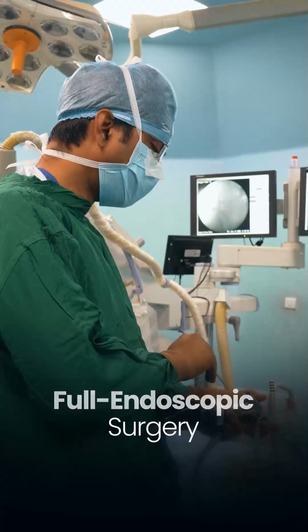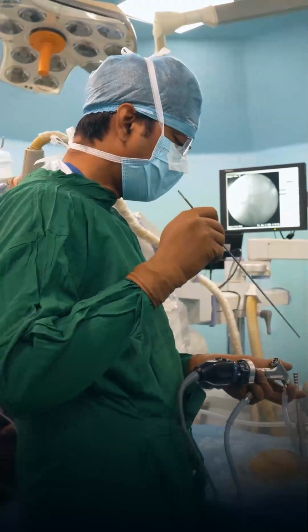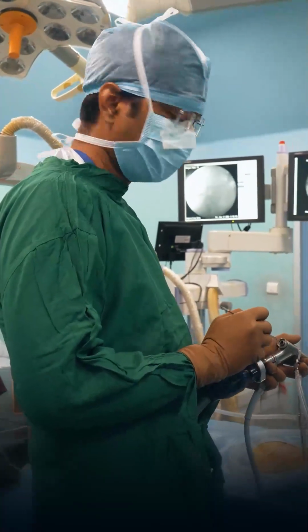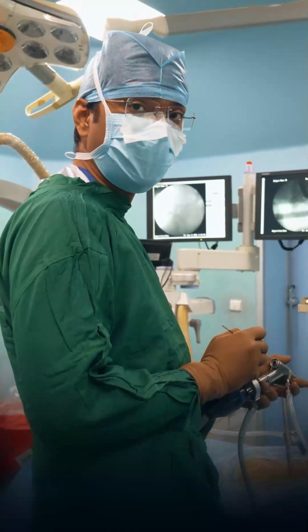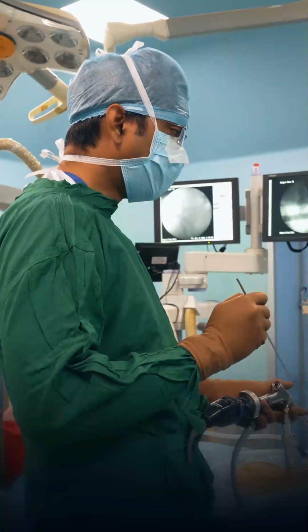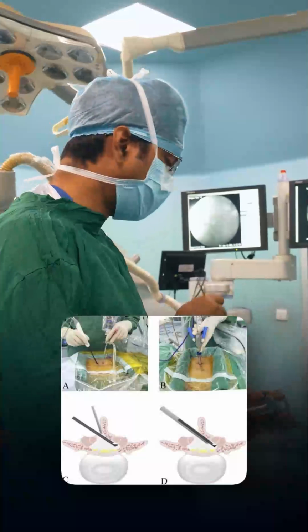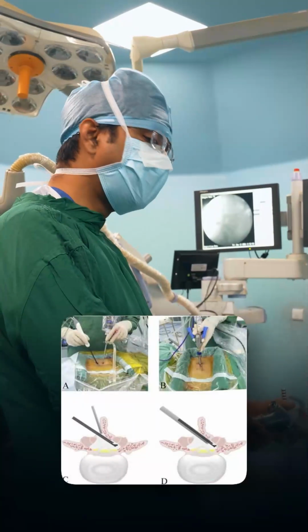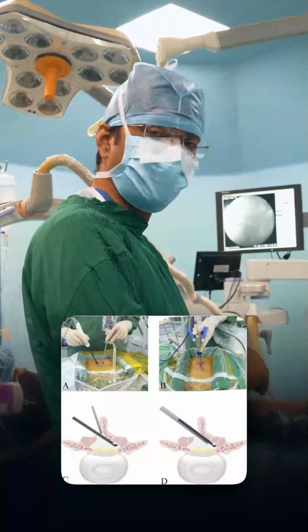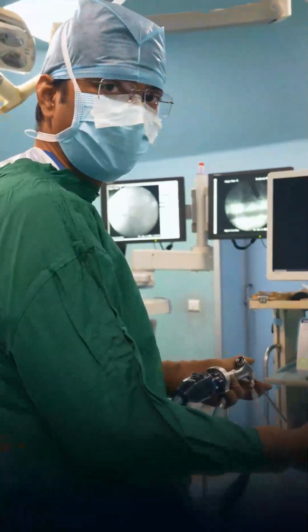Monoport means single incision, single port, single entry, and you can operate through this endoscope which has a working channel associated with it. In biportal, there are basically two pieces of equipment. One is the scope, the other is the working instrument. So they have to make two incisions for this. But here we operate through a single incision. That's why it's monoportal surgery, and it is relatively less invasive than the biportal surgery.